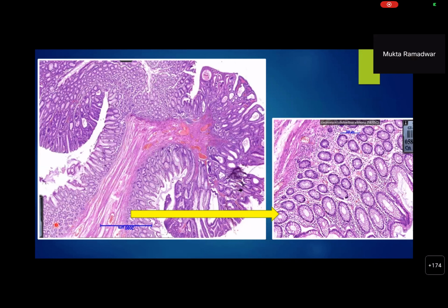Right? And that is what is shown here. This is a completely normal benign colonic mucosa, and the actual epithelial polyp really begins where the stalk ends, and that is here. Okay, so this is actually the part of the normal colon, which you can say is displaced because of this huge polyp, but the stalk is always lined by normal benign colonic epithelium.